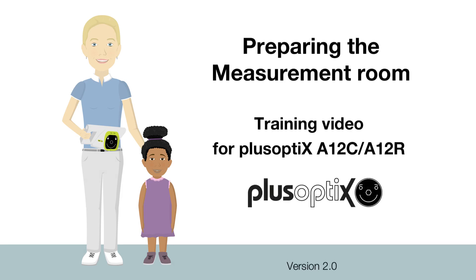This PlusOptics training video will help you prepare your measuring room for optimal measurement results using your PlusOptics A12 binocular autorefractor.